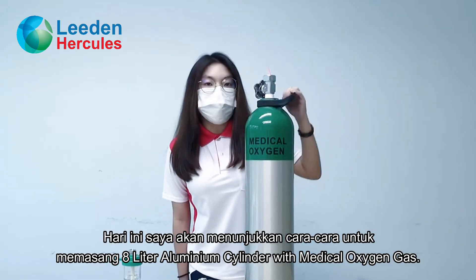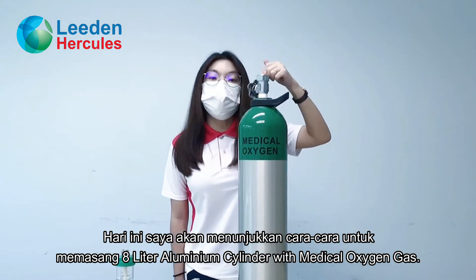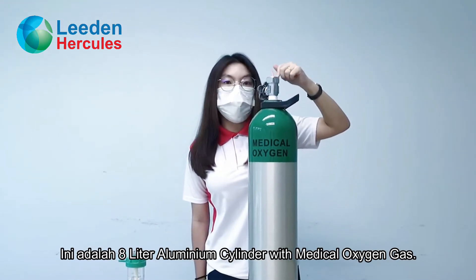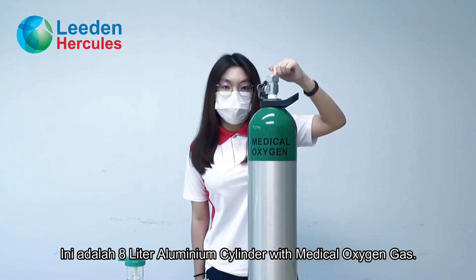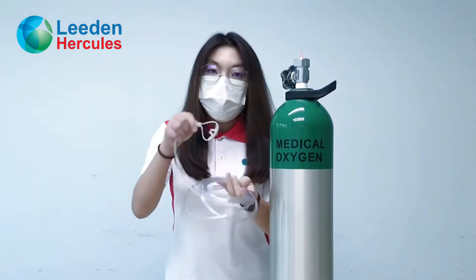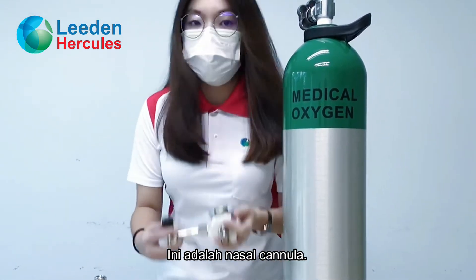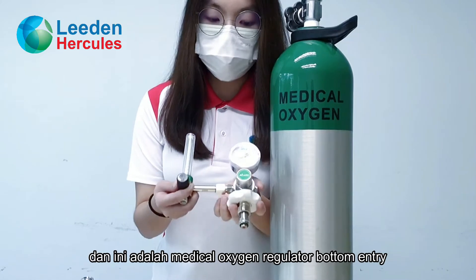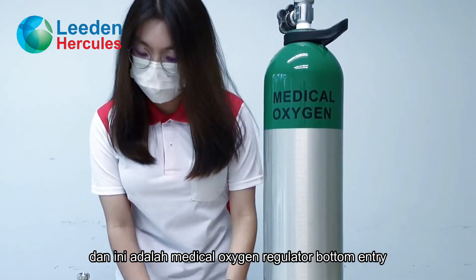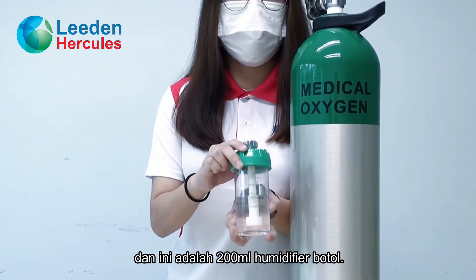Hello everyone. Today, we are going to show how to install an 8-liter aluminum cylinder with medical oxygen gas. This is the 8-liter aluminum cylinder with medical oxygen gas. This is the nasal cannula. This is the medical oxygen regulator bottle entry. And this is the 200 ml humidifier bottle.